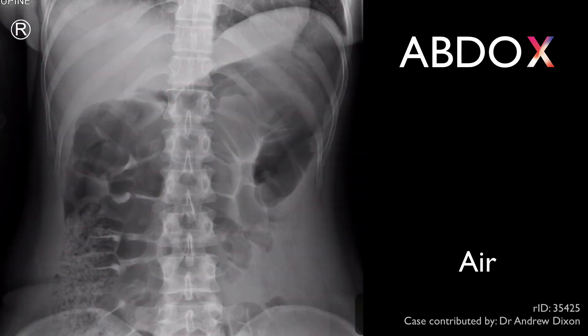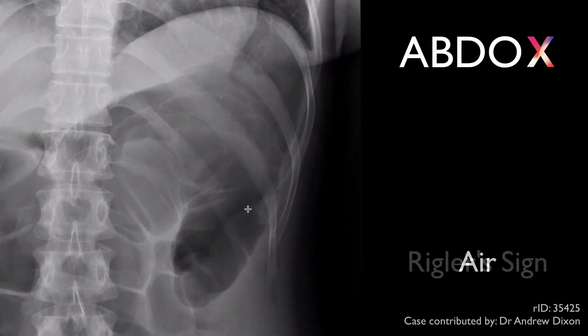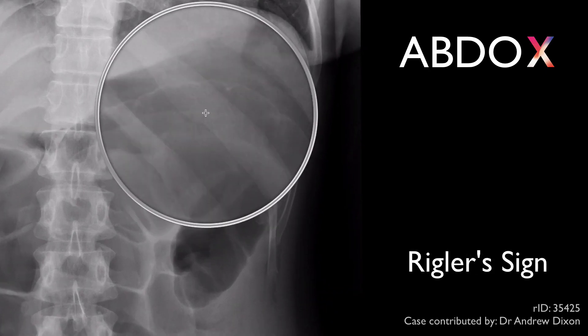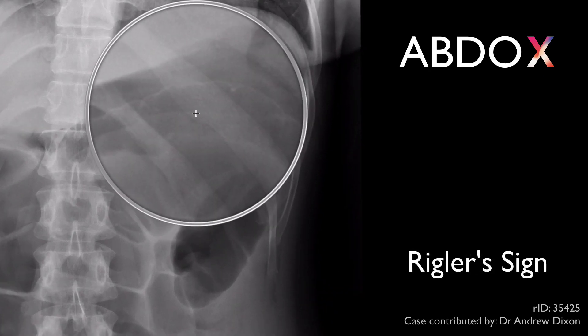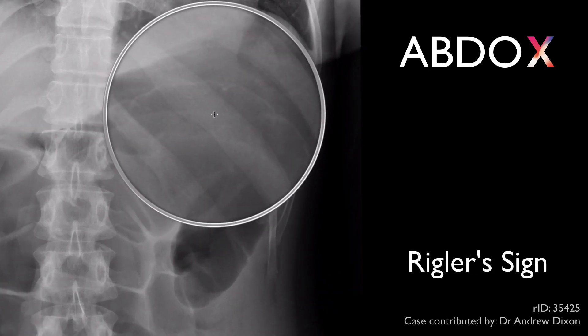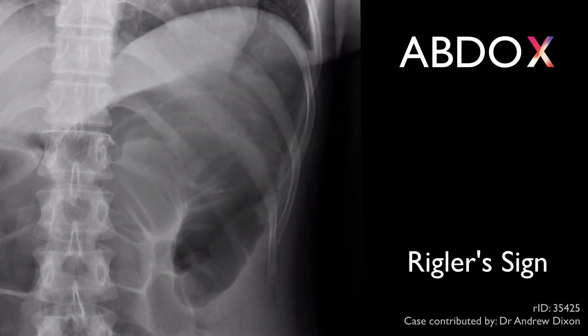Various signs of free intraperitoneal air exist, such as Riggler's sign. Here, the bowel wall can be seen very clearly. This is because there is free gas on both the inside and outside of the bowel wall.